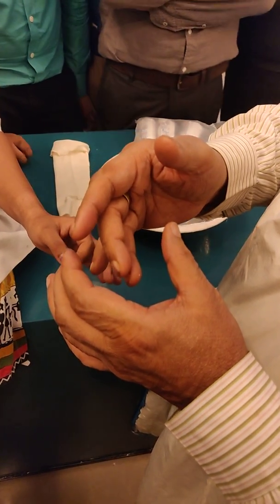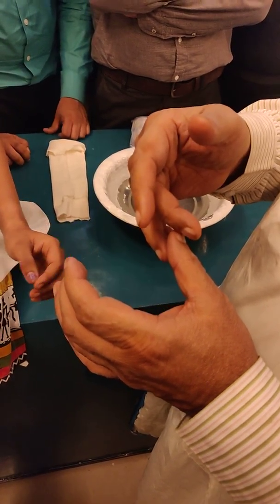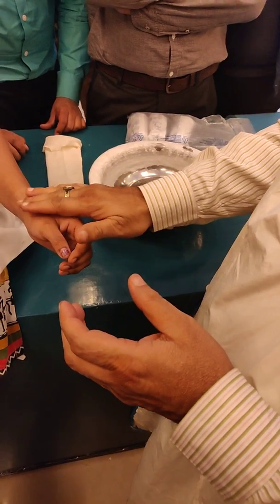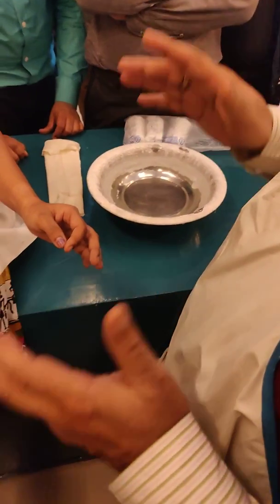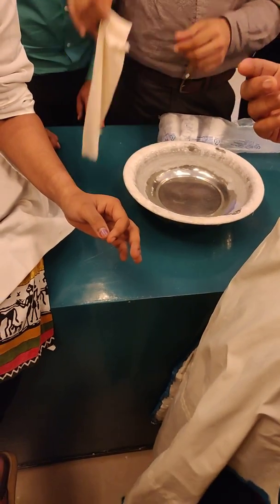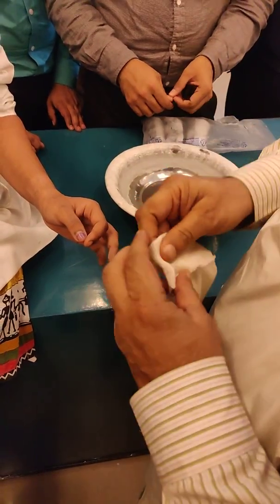The waist can fracture, and it can damage the blood supply to the proximal fragment. Therefore, the proximal fragment may become avascular and not unite. But in this case, we expect that it will unite. Only the fracture was not diagnosed — not seen on X-ray — and hence the patient is coming after 2 to 3 months of injury. So we will try to treat this.